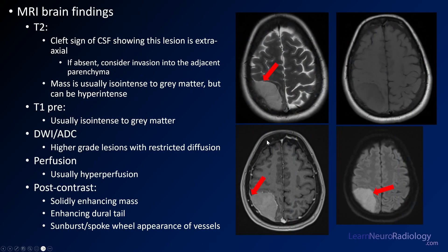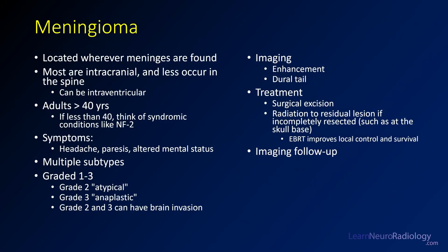On MRI, we have the T2 cleft sign, avid enhancement, and dural tails. On diffusion, we have diffusion hyperintensity — with tumors, this usually comes from tightly packed cells where water doesn't move freely. This etiology typically has hyperperfusion, can be FDG-avid, is usually solidly enhancing, and the spoke-wheel pattern seen faintly on T2 is also characteristic.